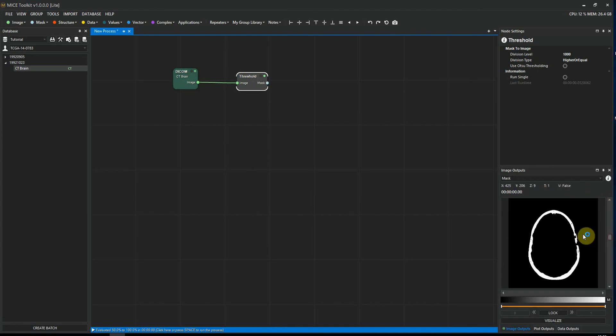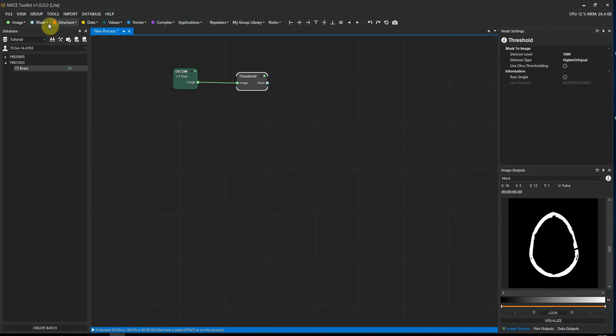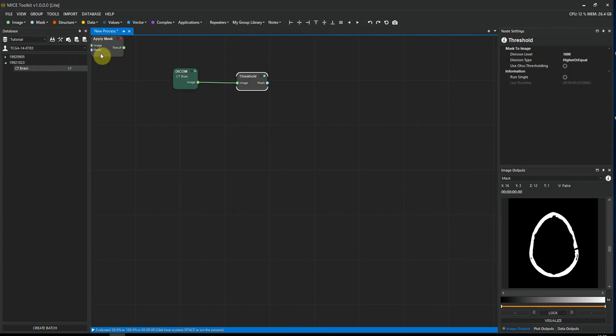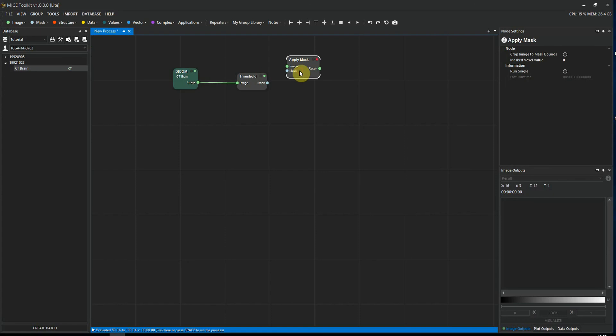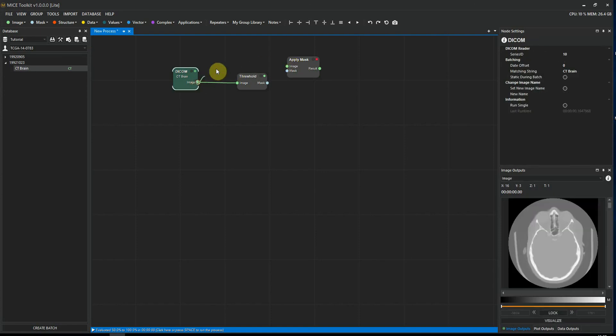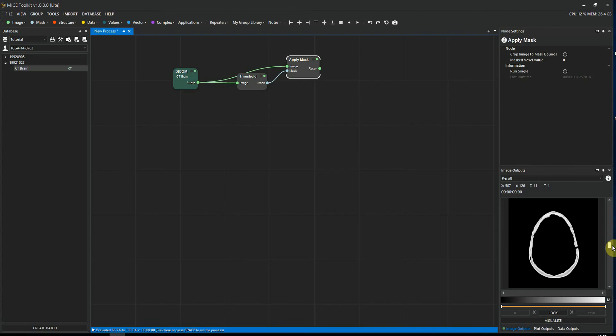Now this is a mask. And instead of displaying voxel values, we can see that we display true or false. So this looks quite nice. We have segmented the bone in this image. Let's say we want to apply this mask to the image. You can do that by going to mask, apply to image. Now this node takes two inputs. The image and the mask. So I'm just going to connect them. And then I'm going to hit spacebar to execute the workflow. If I highlight this node, we can go back down and we can actually see now that we have not a mask anymore, but just a segmented image.